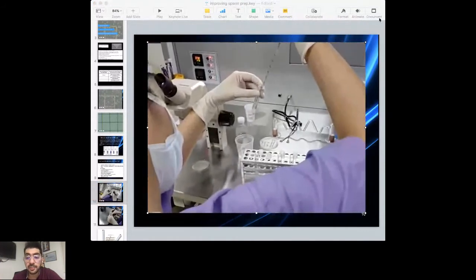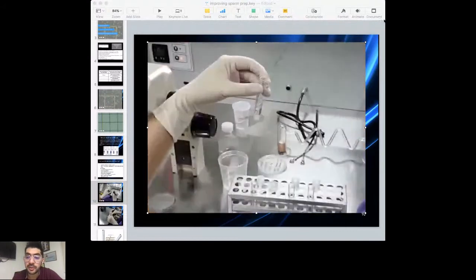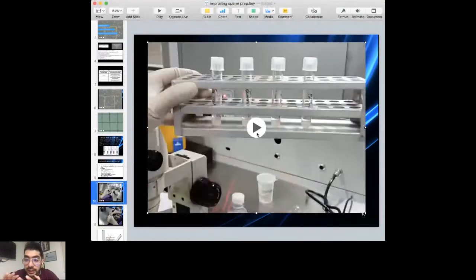Well, this is a very important step because there are a few people typing, so let me wait for their answer. But you can see that the embryologist here is layering so carefully that you avoid any kind of mix-up of the medias. Ankita says that there is less disturbance. Saraswati says that to get a good interface. But what you want to do here is understand.